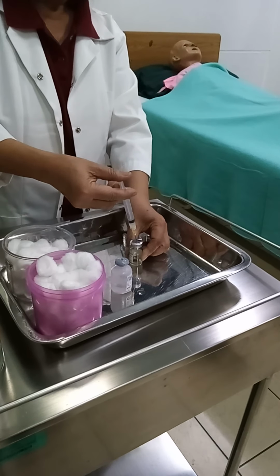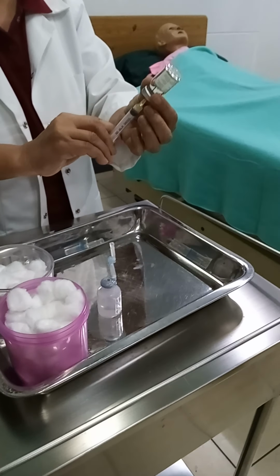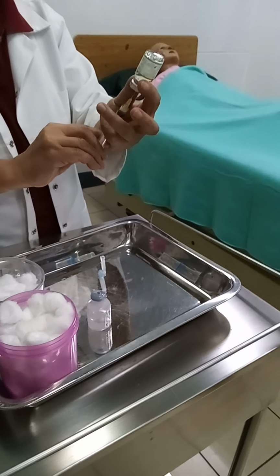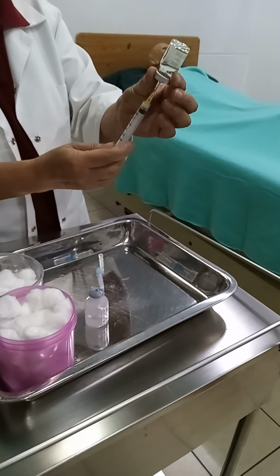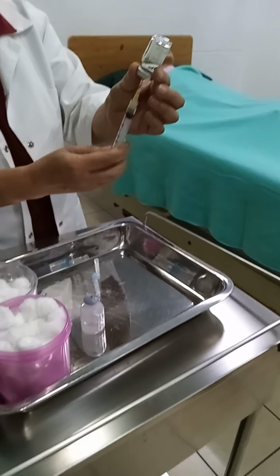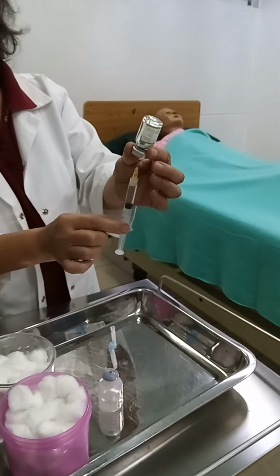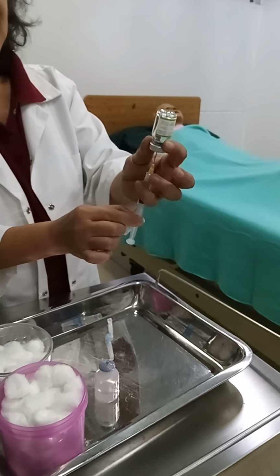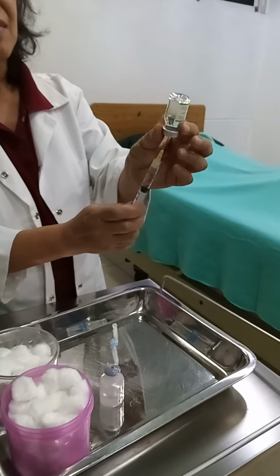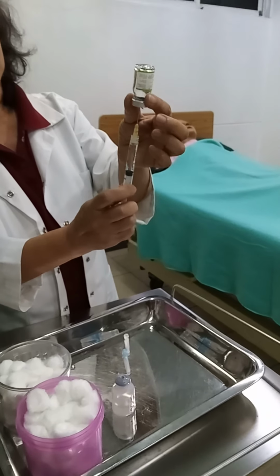Inject air into the vial, holding on to the plunger firmly. Invert the vial, keeping a firm hold of the syringe and plunger. Keep the tip of the needle below the fluid level. Allow air pressure from the vial to fill the syringe gradually with medication. Then pull back the plunger slightly to obtain the correct amount of medication.